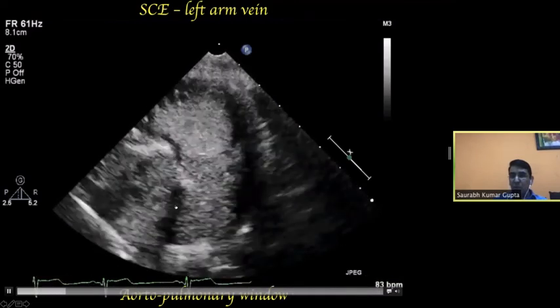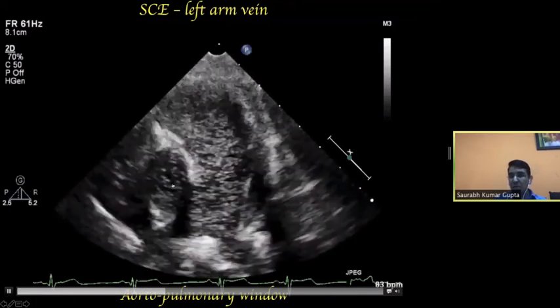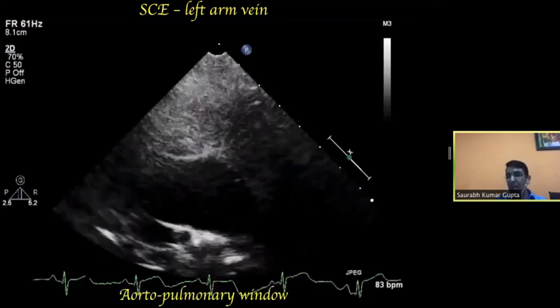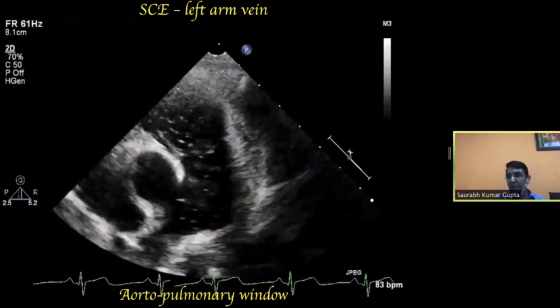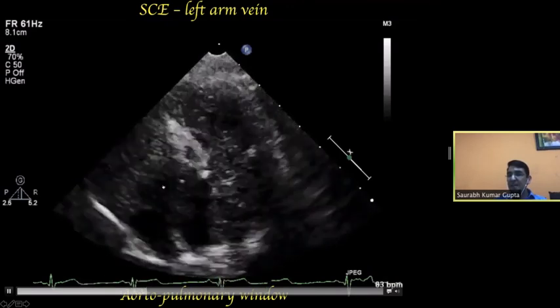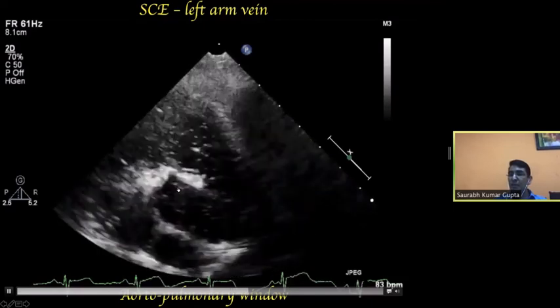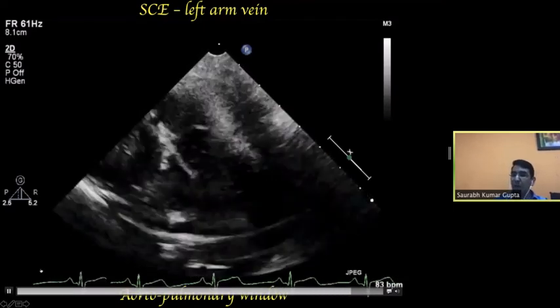And I think you focus on the initial part, that it is getting into aorta. So once it is reaching aorta, there has to be a right to left shunt. Now, whether it is reaching into aorta early in the phase or late in the phase, if it reaches very early, like it is happening in this case, it suggests there is direct communication between pulmonary artery and aorta. So in this case, we are dealing with aortopulmonary window, which is another treatable lesion if picked up in time.